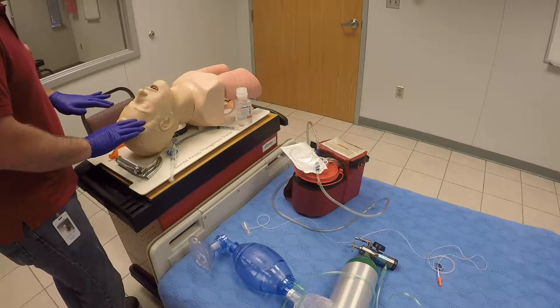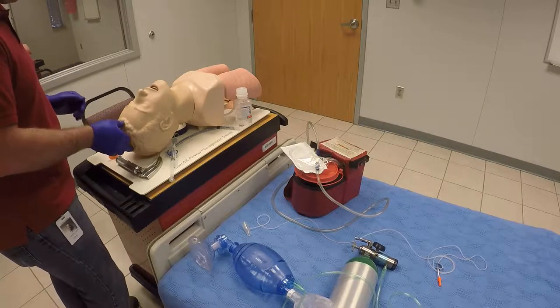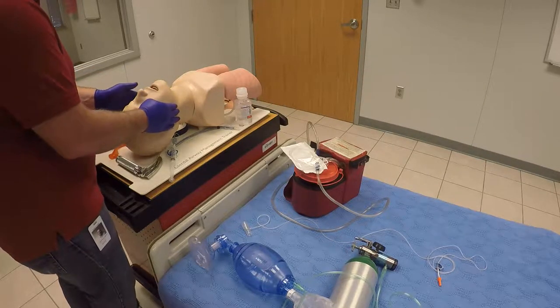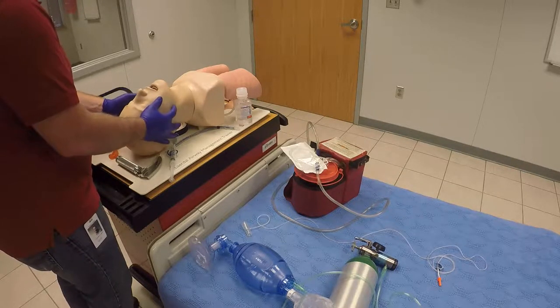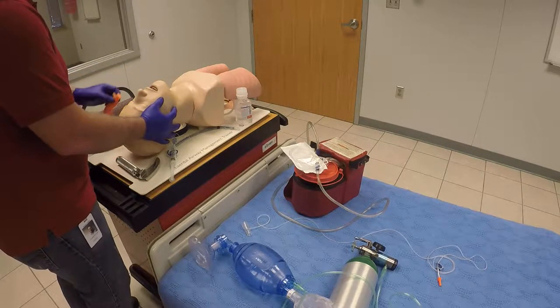First thing I want to do is make sure I have my PPE on — got my gloves on, and if necessary I'll have a face mask or goggles on. I'm going to open my airway. I can either use the head tilt chin lift or the modified jaw thrust. Of course in any trauma, you want to use the modified jaw thrust and maintain the neck and head in a neutral position.